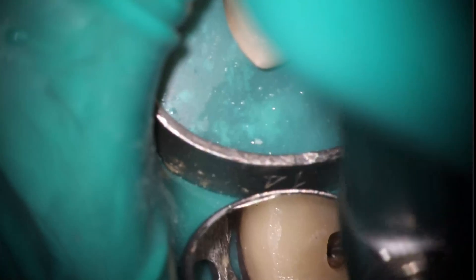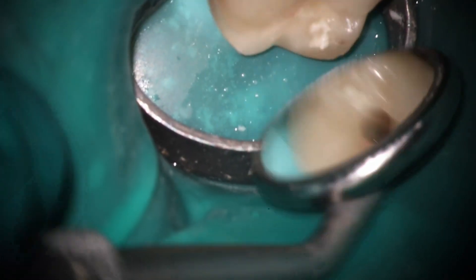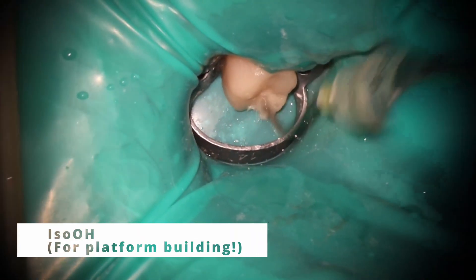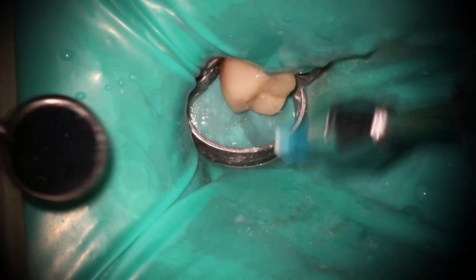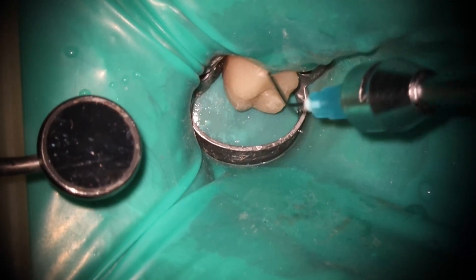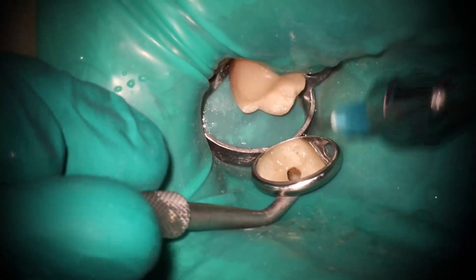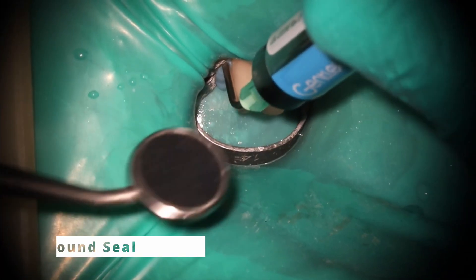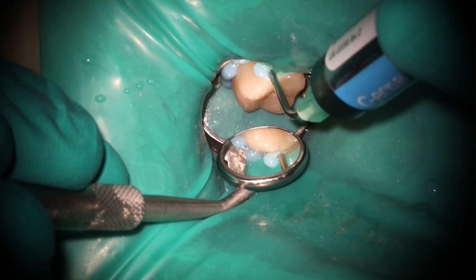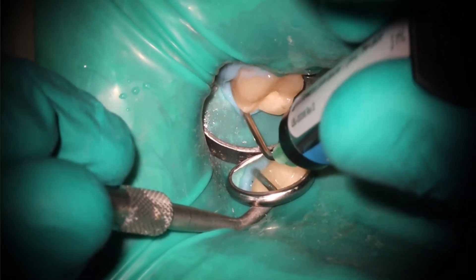I thought because of this case and some unique things about it, it's worth showing. When I do the GentleWave, I do a couple things differently. Number one, I'm not really getting length here — I still want to take at least the 20/06 about a half, if not two thirds down. At about that three to five minute mark, I am starting to build the platform. A lot of people when this first came out thought of the machine as a great disinfecting tool; I think of it as doing a lot of the cleaning and shaping for me — I use this almost in place of other rotary files.